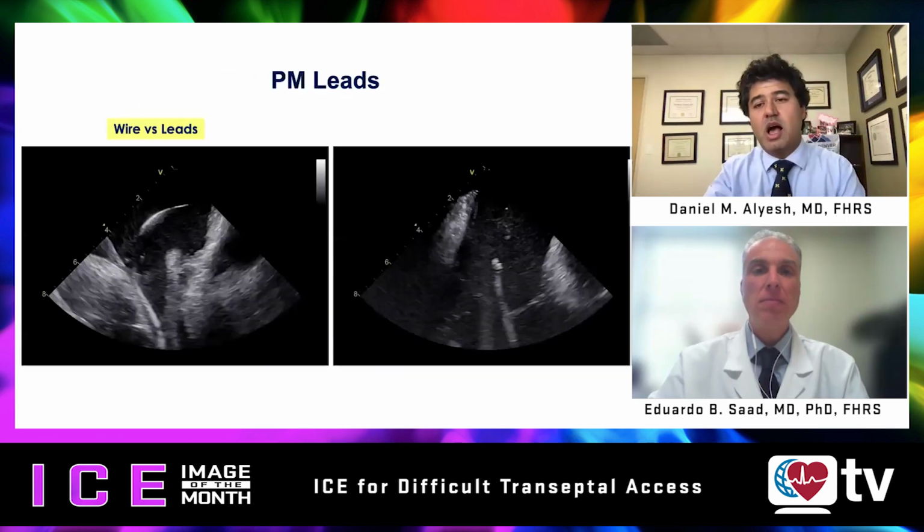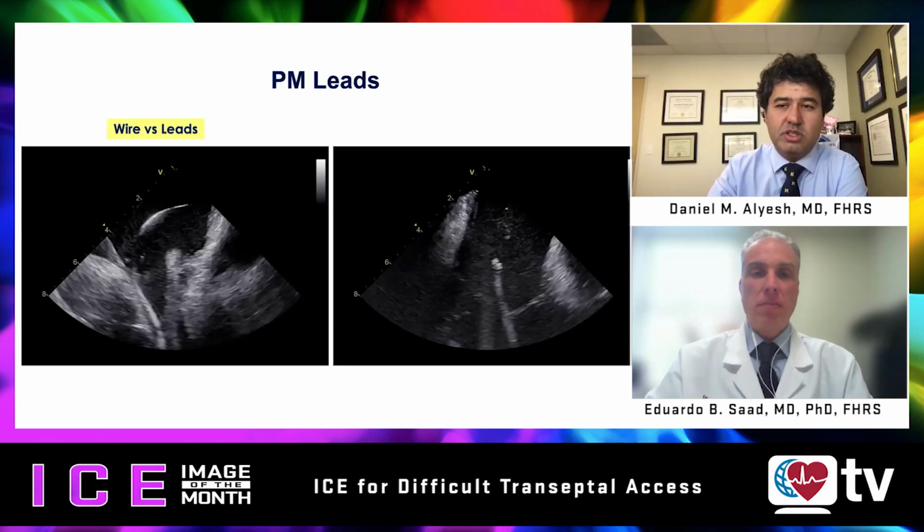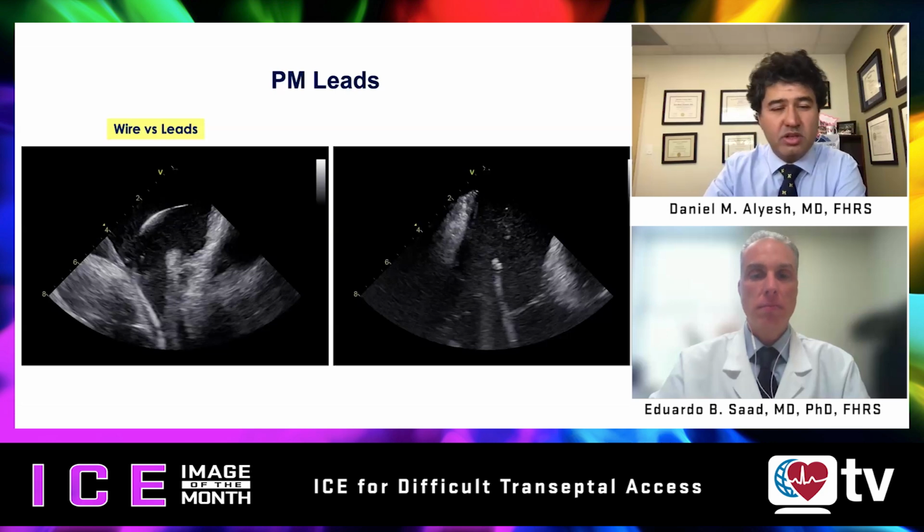I think also a common misconception is about the ability to perform transseptal, or quite frankly any procedure, in the presence of CIED wires. You have a couple of very nice examples of how to differentiate CIED wires from the J wire, and how to troubleshoot doing procedures with CIED wires. I'll let you narrate a bit of what we're seeing.